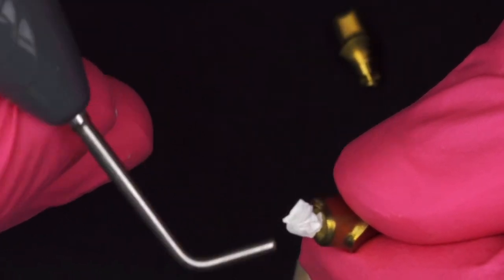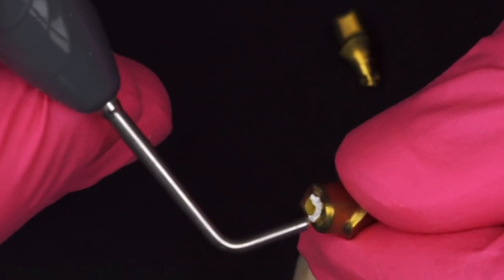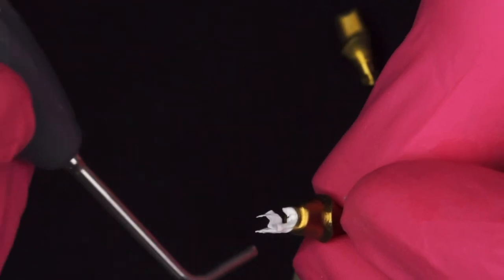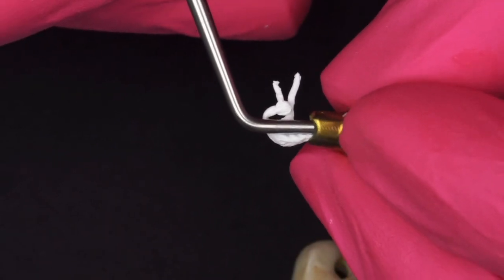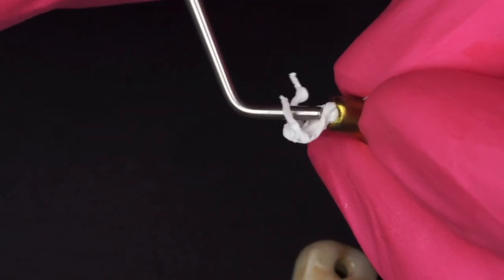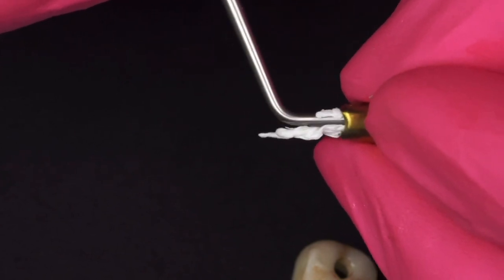Next step is to finagle some teflon tape in the access hole. I don't quite have enough here, but you want to make sure you pack it in tight. It's essential that you don't get resin down into the chamber of your abutment that could interfere with the way that the screw fits inside and could cause unnecessary friction.